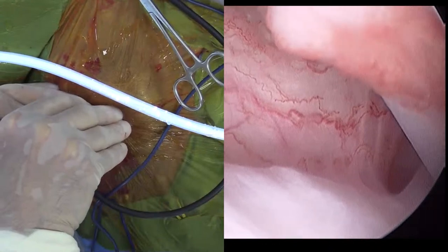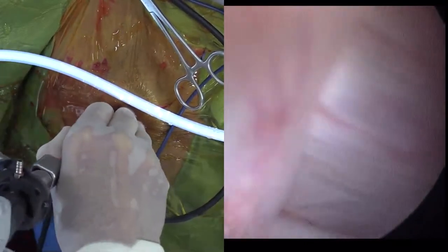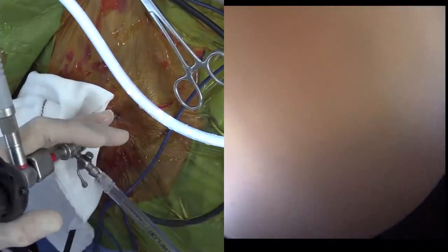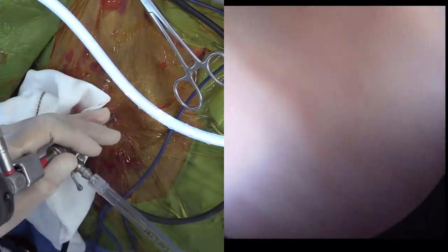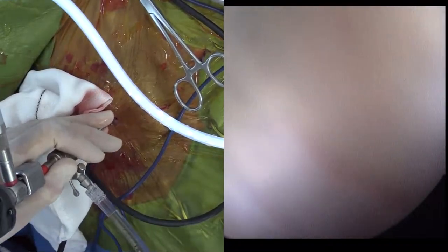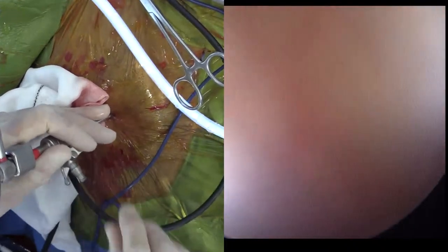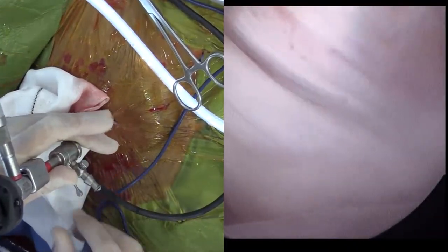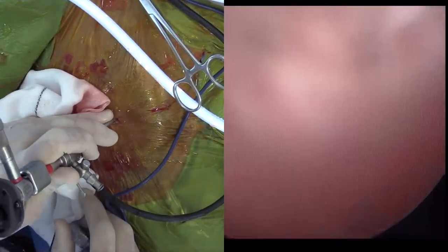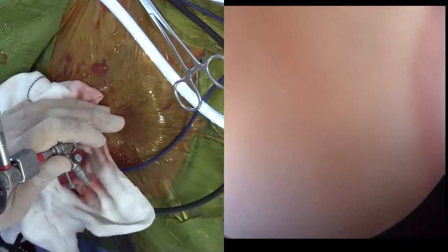I think that's all we're going to do here. I'll inject some lignocaine into the joint, and I might also inject some corticosteroids. I'll stop the pump so there's less fluid in the joint — that way it won't dilute out the steroids and is less likely to leak out. I'll let the fluid run out a little bit, then inject the steroids right through the fluid port on the scope.